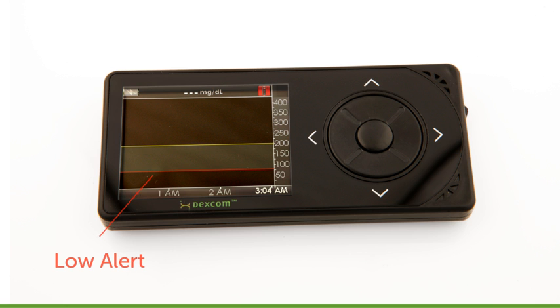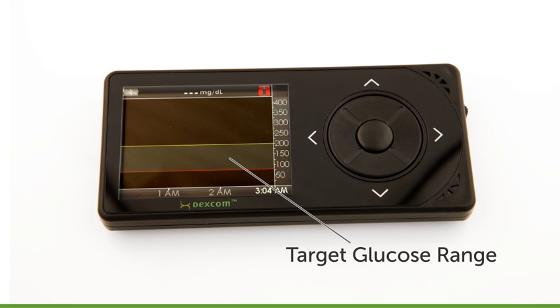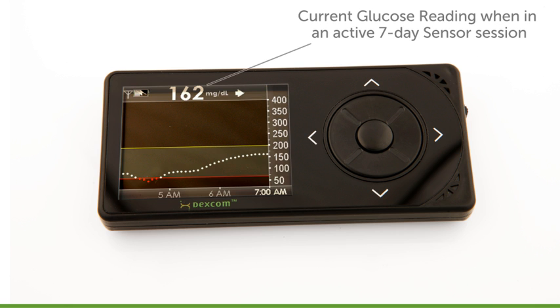Your low alert setting is seen as a red line across the trend graph. Your high alert setting is seen as a yellow line across the trend graph. You will also see the following on your trend graphs: a gray zone that highlights your target glucose range. The size of your gray zone will depend on your high and low glucose alert settings. Your glucose reading as a numerical value when you are in an active sensor session. In other words, once you have started your 7-day sensor session.